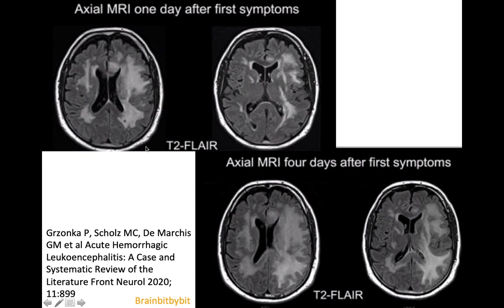This is a patient with MRIs only three days apart. On the initial scan you can see the patchy white matter abnormalities resembling ADEM, but after three days there is very rapid progression of the white matter abnormalities and a lot of brain edema.